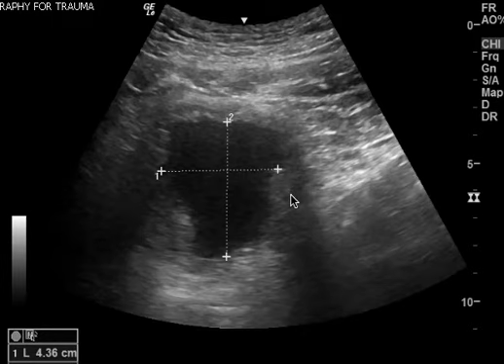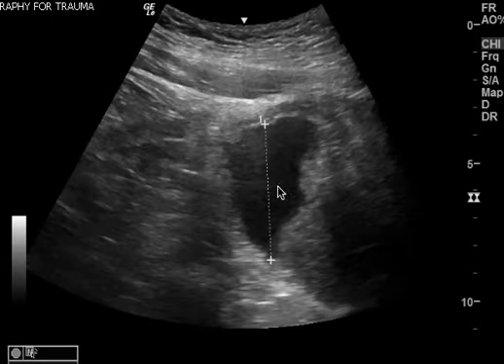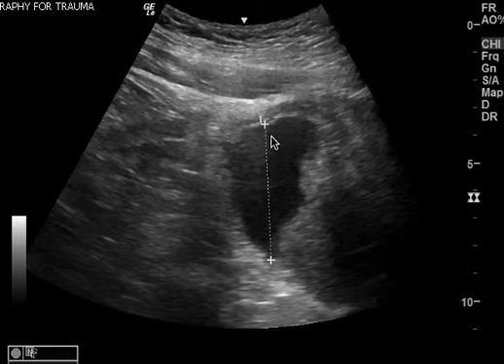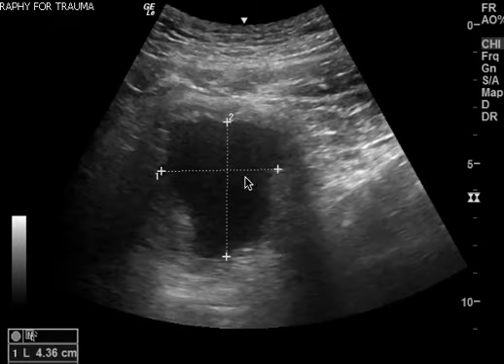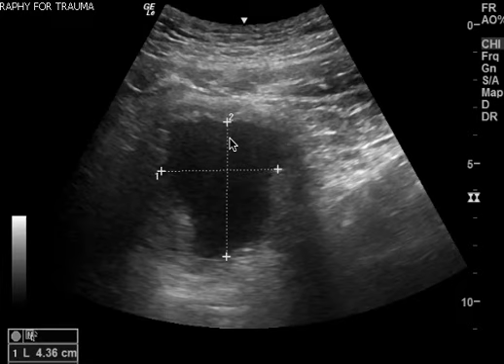So this is perfect. You just want to go from this point to here, as opposed to this, because this corresponds to one of the measurements here. So you did either the height or width here twice.